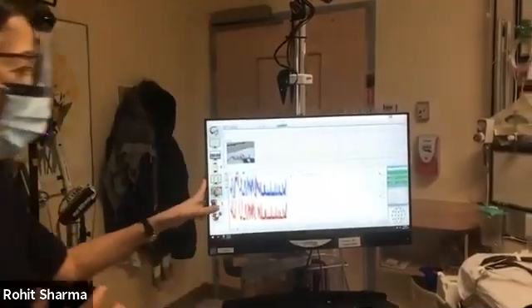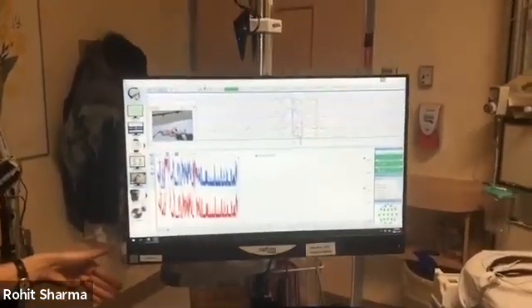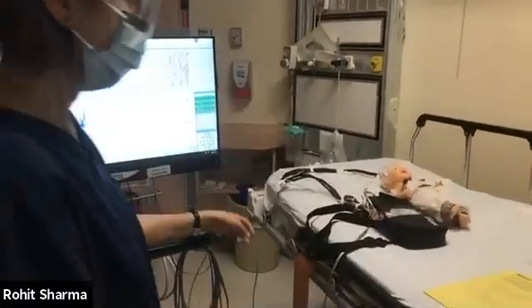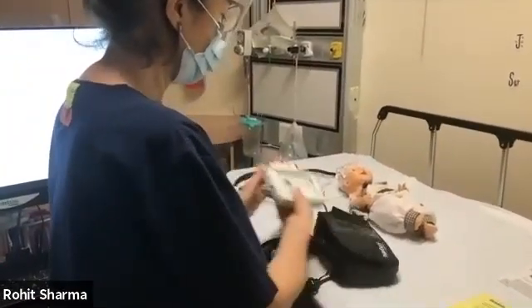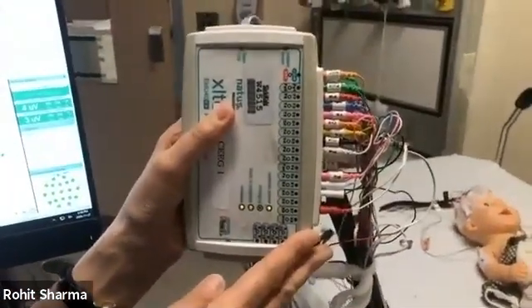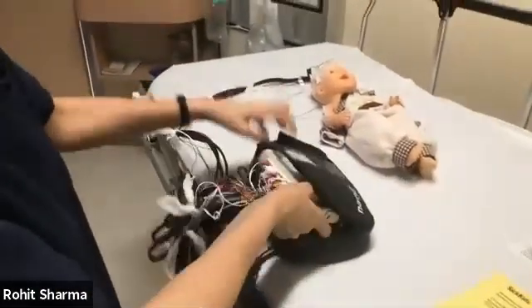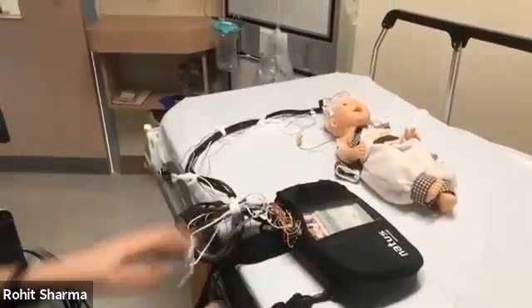So this is one of our EEG machines. It has, of course, the internet connection, and it has a power cable. The patient is also connected to the EEG machine with this gray cable, which goes into the amplifier. This is our amplifier. The amplifier is where all the electrodes are plugged in, so it's easy to see that they're stable and connected really well. So we leave them plugged in. They're in a bag beside the patient on the bed like that. So that just covers the EEG system.